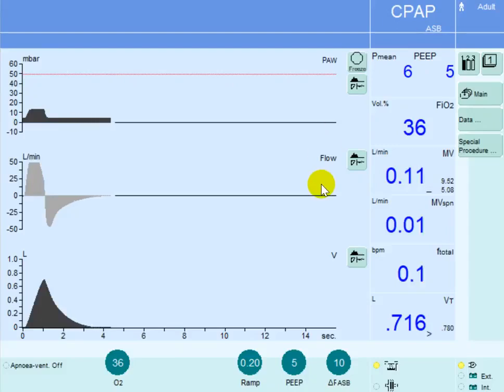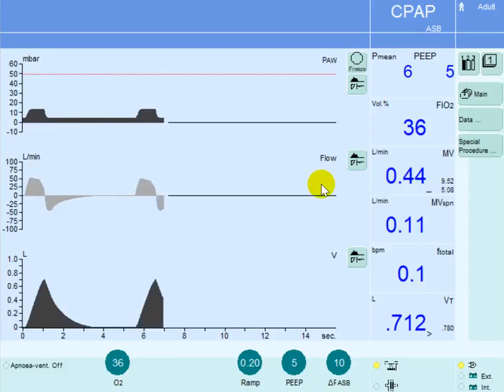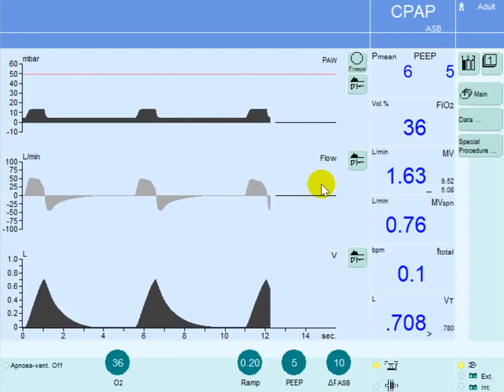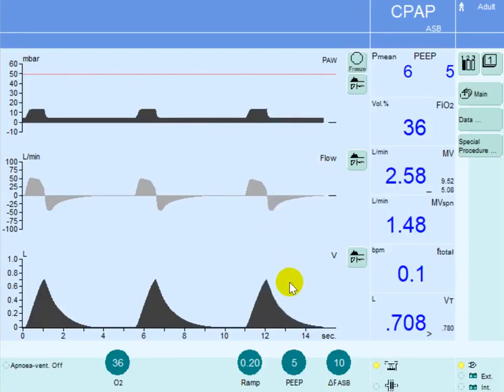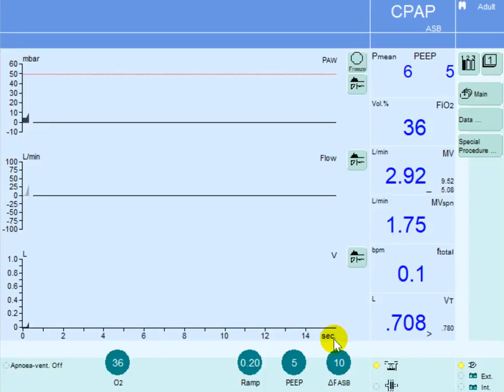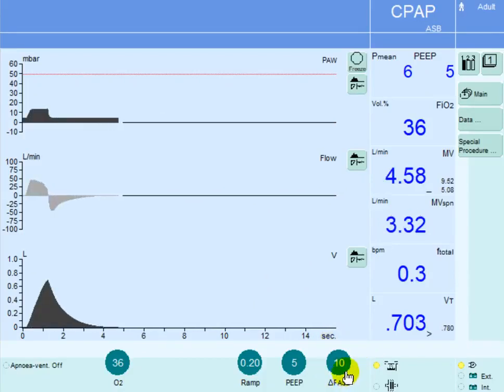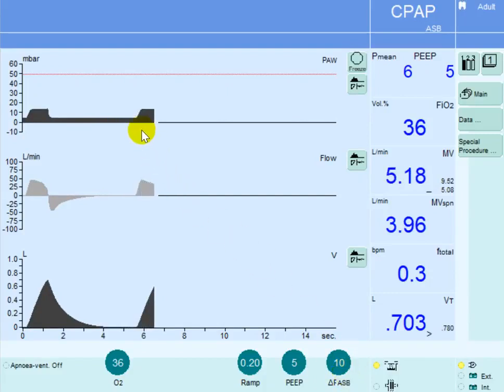In this video we will explain wasted patient efforts due to low sensitivity level. If you have a patient on pressure support mode of ventilation with pressure support set at 10 centimeters of water, the machine will be triggered by the patient.